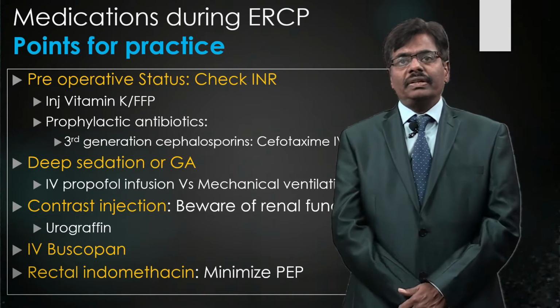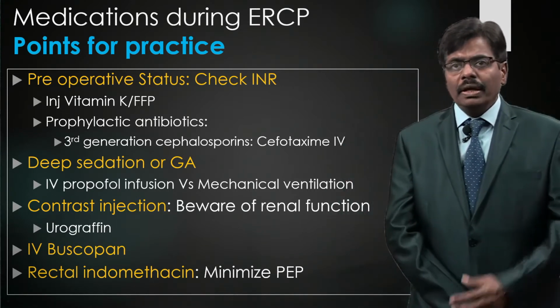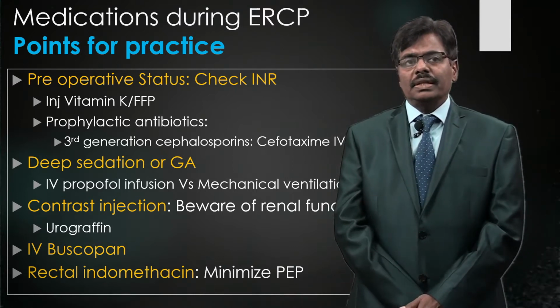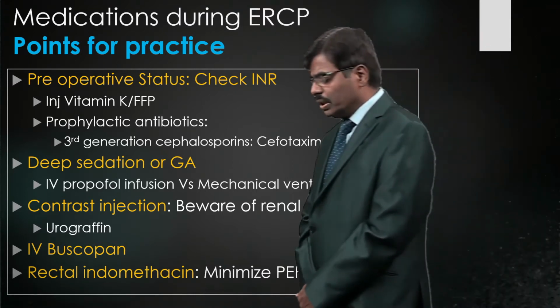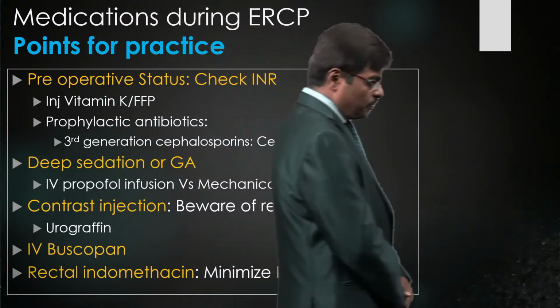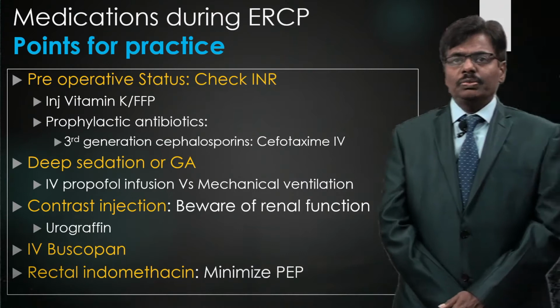Then if it gets infected, if it is not drained properly and definitely early, then there is a chance of cholangitis and sepsis. So be careful about injecting too much contrast or too much pressure, especially in an obstructed system. Buscopan, yes, we do use Buscopan.